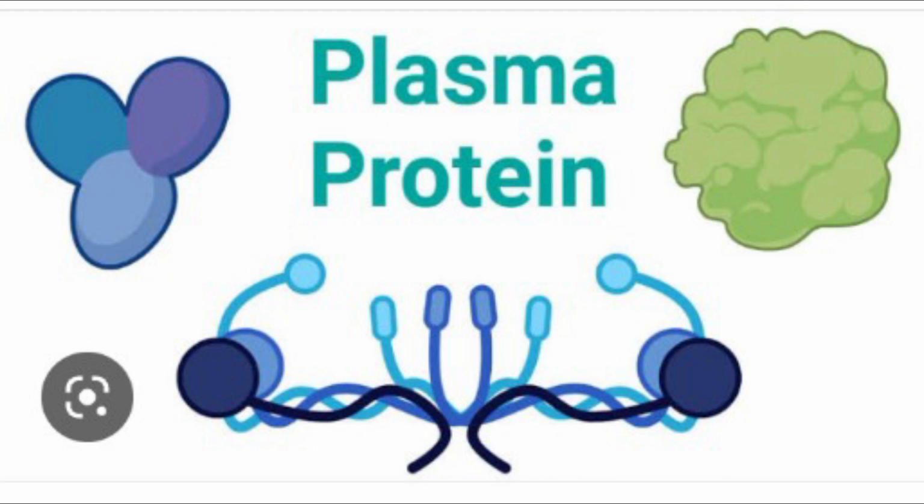Dipstick test. The plastic strip has a cellulose area containing dye and a buffer, which reacts with the albumin and gives color. Note: if the urine is acidified, the test may be false negative. If the urine is alkaline, the test may become false positive.